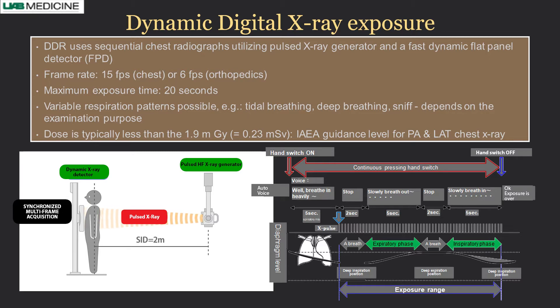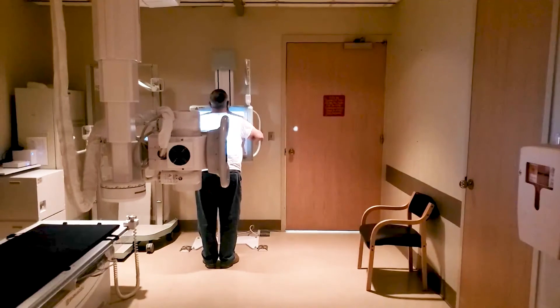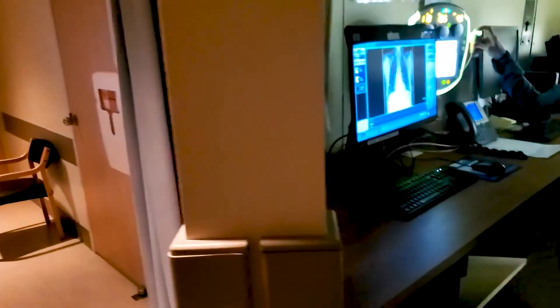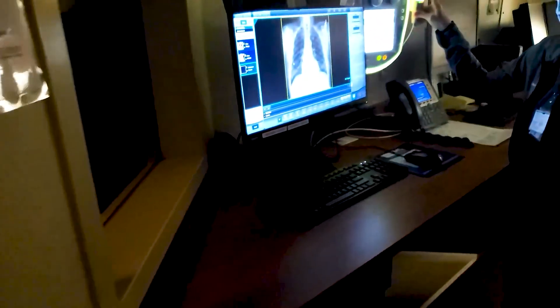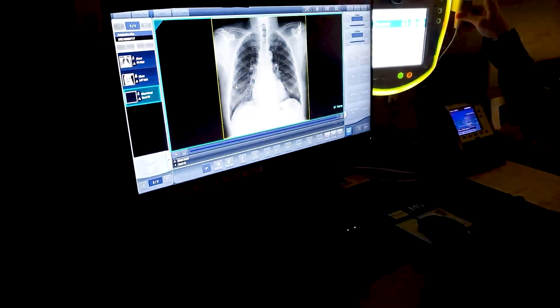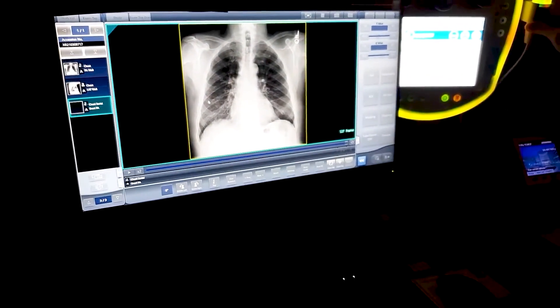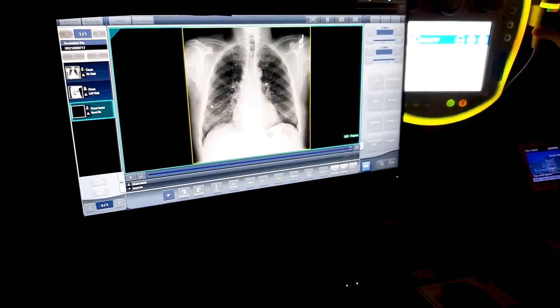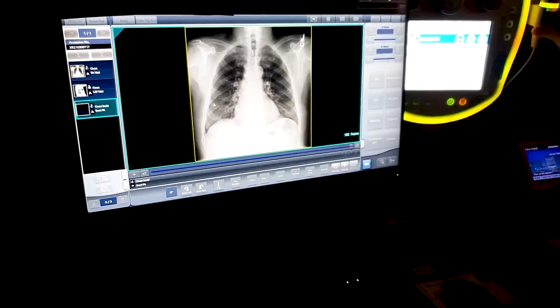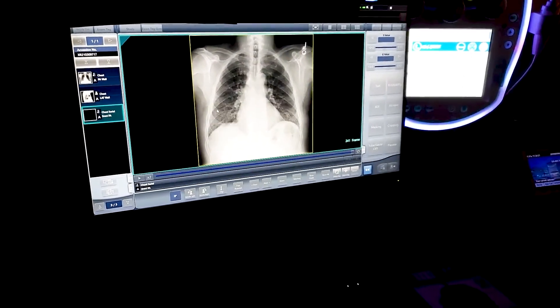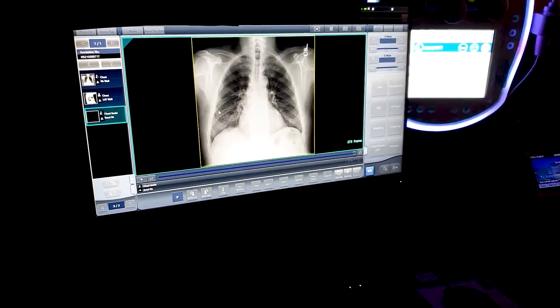Essentially, pulse radiograph — pulsed X-rays come from the generator, pass through the patient, and go to the flat panel detector. This small video shows how it is done: it's a standard PA view with the X-ray source here and the plate in front. The technologist keeps pressing the on button, and there are instructions by auto voice to keep breathing. Once it is done, the technologist releases after whatever assigned period of time, and then you have the images.